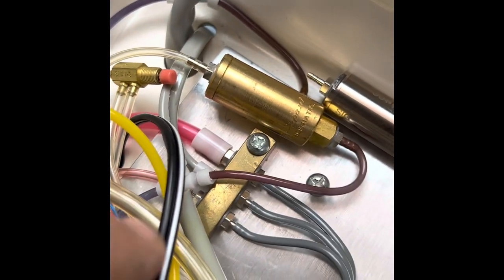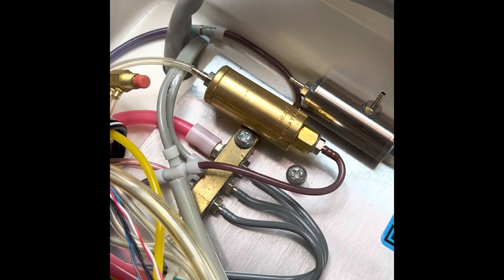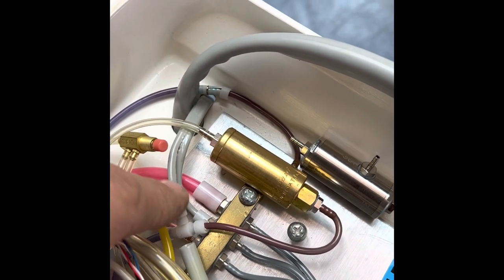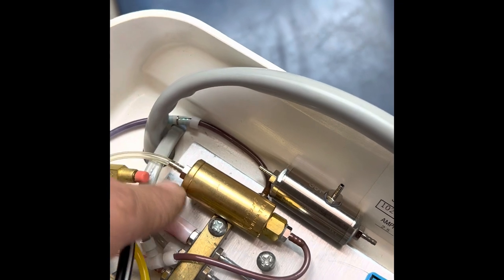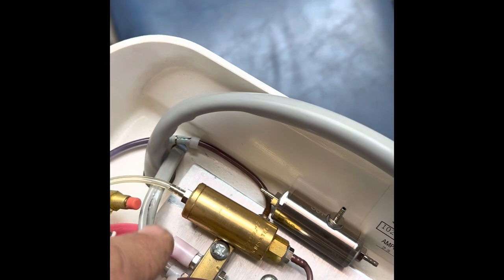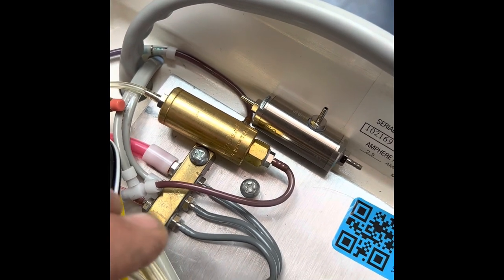So what I'm doing is right here, this is the water inlet. I'm pinching this and that's fixing the problem. So see right here, that's the water going to the syringe. And when I pinch this line, the water stops going through, or the air stops going through. So the air has to be coming through this right here to go out my air water syringe. This is a crazy problem. So I'm gonna replace the water relay and hopefully it fixes it.